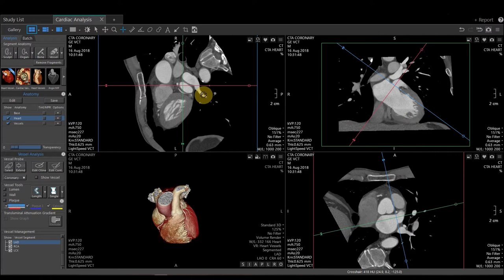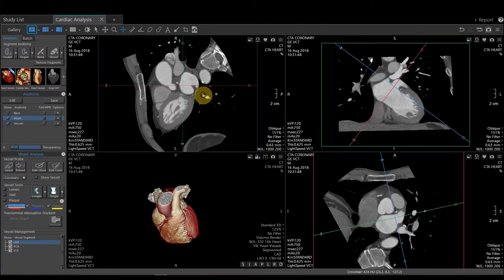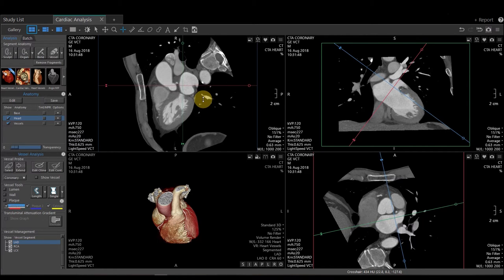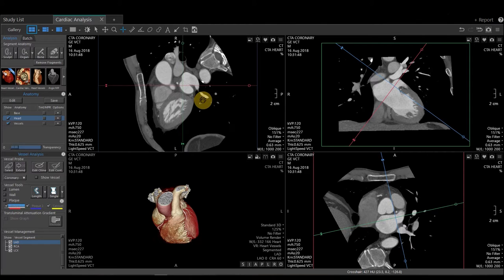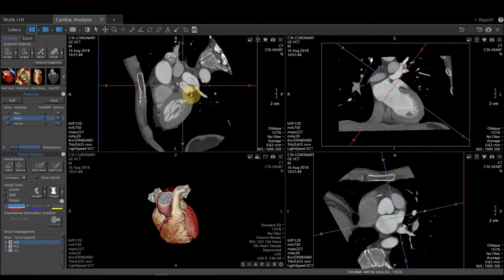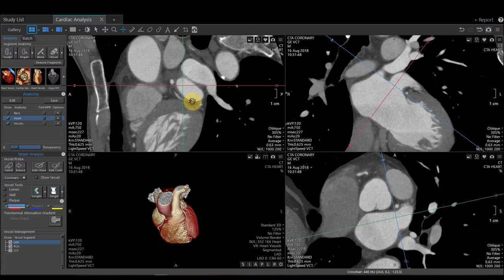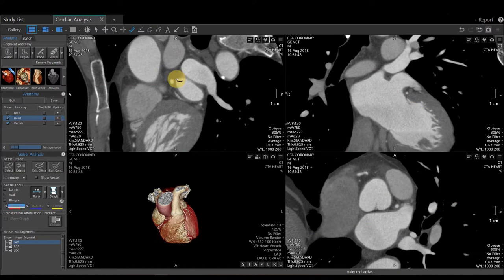I'm then going to come to my sagittal image and I'm going to scroll forward and back. I'm currently in my atrium, so I'm going to scroll until it separates itself. I'll zoom this in so we can see it better. And then I'm going to come up to my toolbar and use my ruler tool to provide a measurement.